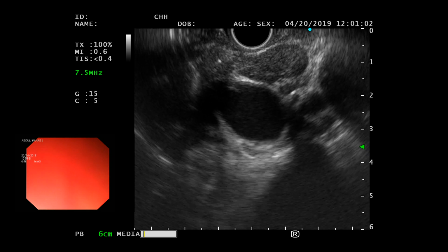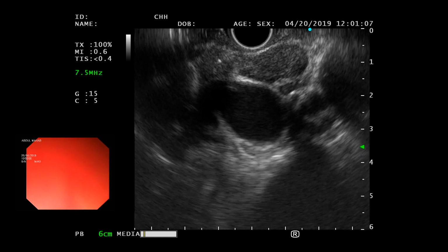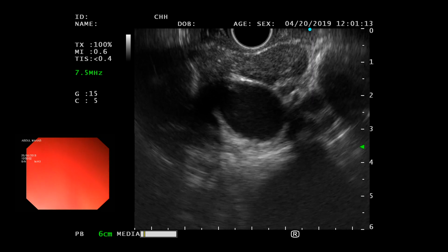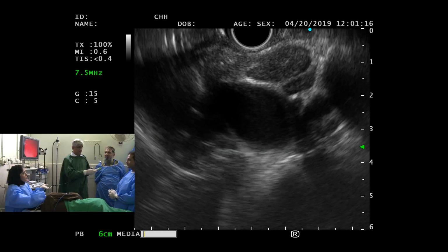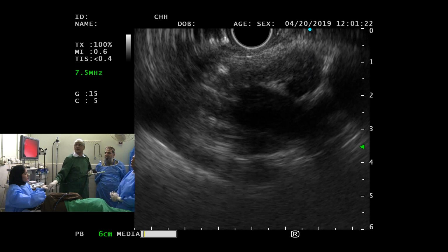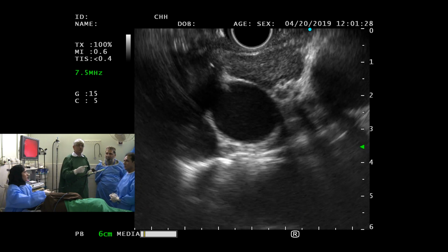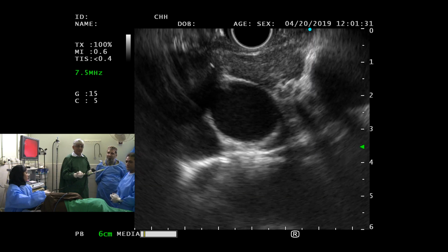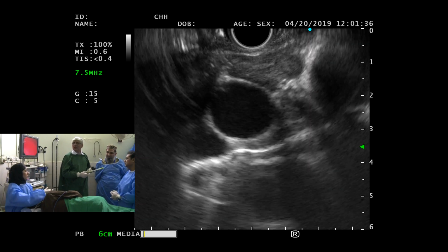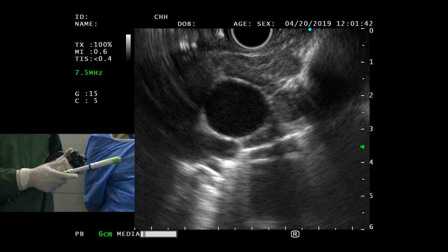The thing that I was telling Khalid, and again maybe this is because... can you appreciate here? Can you see this? Hello? Anybody there? Yes, we can see it. Okay, so I'm now bringing my needle out. This time I did not touch the thing because I had already set it, but this is something that happens with us, Khalid, because you use brand new needles every time, right? Yes. So nobody touches this. Manufacturers set this up and send it to you, probably at 2 or 1.5, I don't know. But in our case, it actually is moved when they're cleaning and all that.